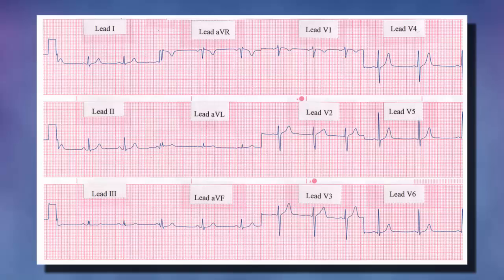These strips are showing a typical 12-lead ECG run. The 12 leads are various combinations of 9 electrodes plus a ground. 4 of the electrodes are on the limbs, including the ground, and 6 are on the anterior chest. The 12-lead ECG is a bit sophisticated for our needs in this class, but it is good to know how this data comes about for future reference.